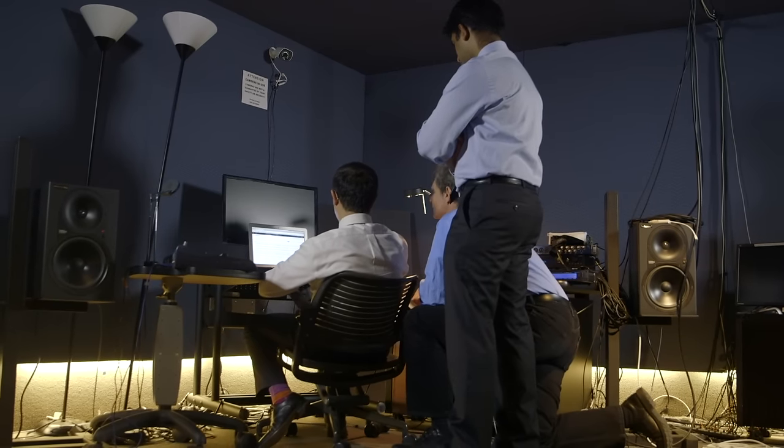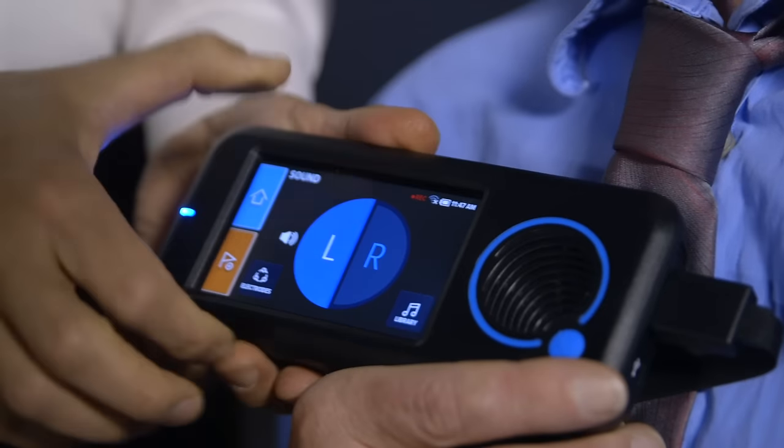So it was really effective for people who don't have as much EEG training to listen to the EEG and get the diagnostic information they need to make a real treatment decision.